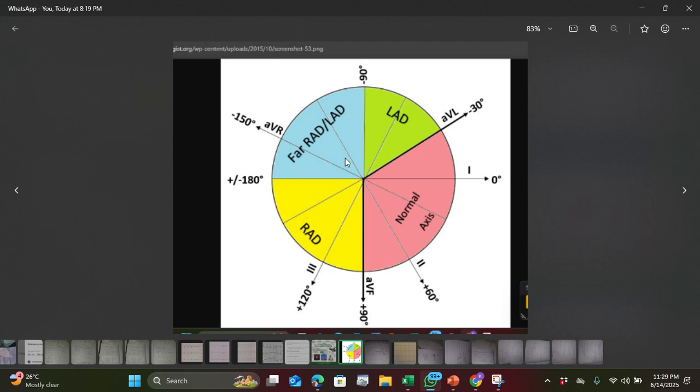Another thing you need to notice is the values. You really have to know the values of this thing. After you divide the circle into four parts the normal way, you have to slash it and slash it again. Now we have aVL, aVR, aVF, 1, 2, 3 on the compass, or on the circle, because there are no chest electrodes in this place.